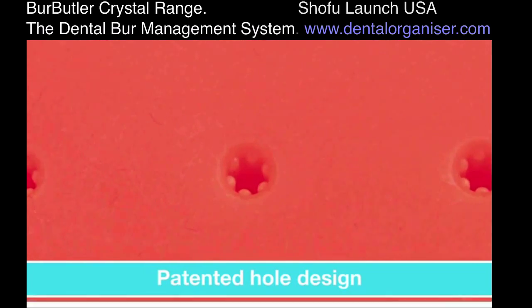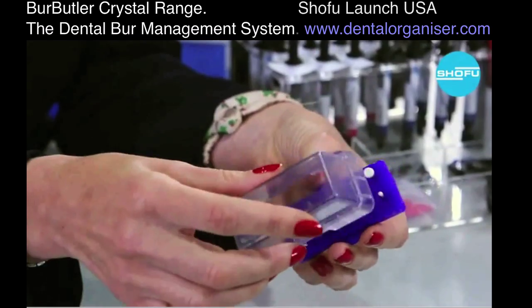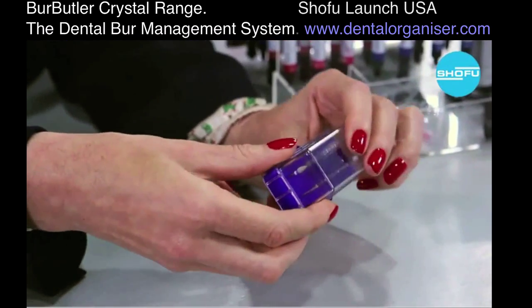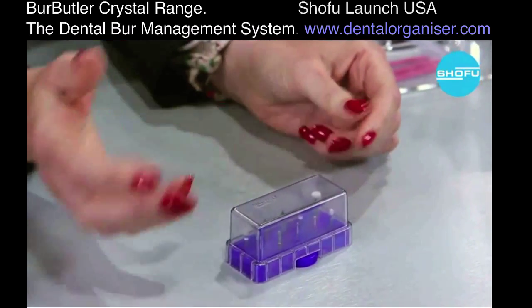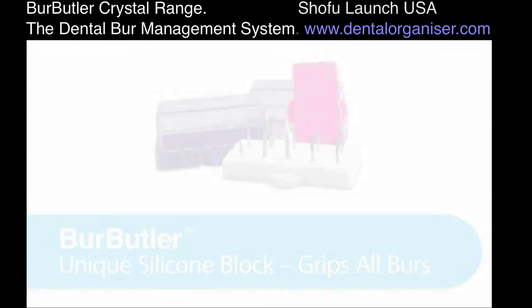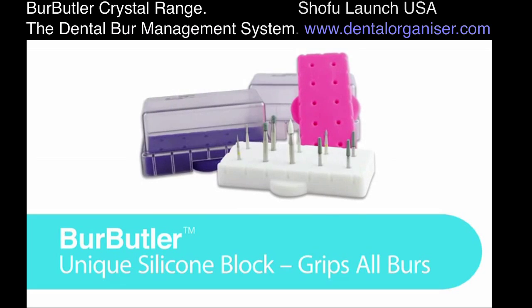This is a really innovative product where you can actually see what you've got in there. It works really well for holding caps as well if you're doing implants, so you can use your caps and you can also organize them. So this can be used for multi-purposes, not only just for holding your burrs.